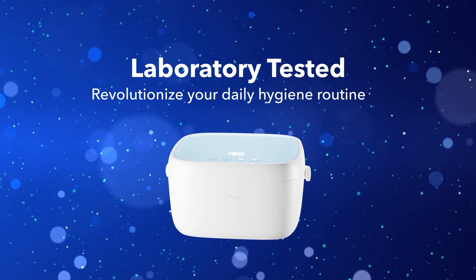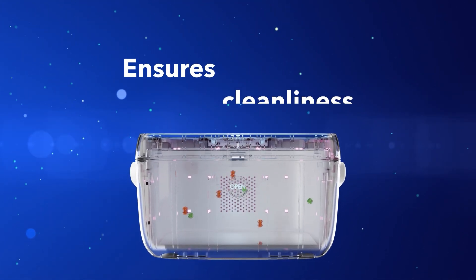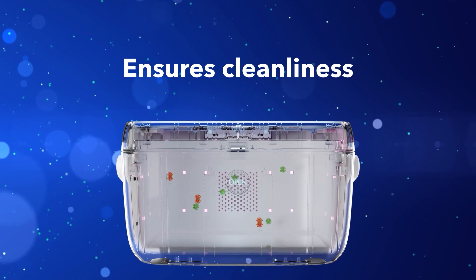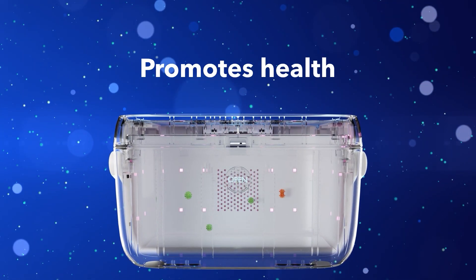Revolutionize your daily hygiene routine with the Paptizer Smart Sanitizer. Say goodbye to 99% of bacteria with the touch of a button and reduce the risk of respiratory issues and other health problems associated with unclean items.